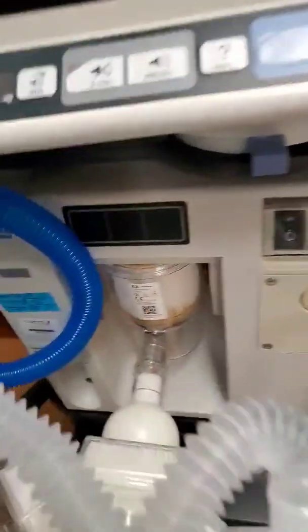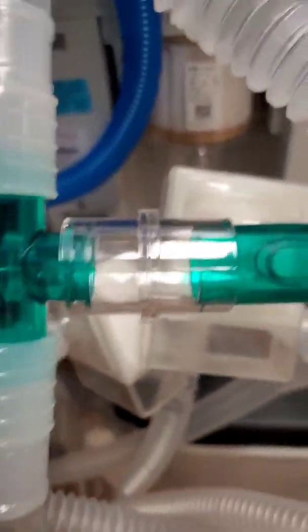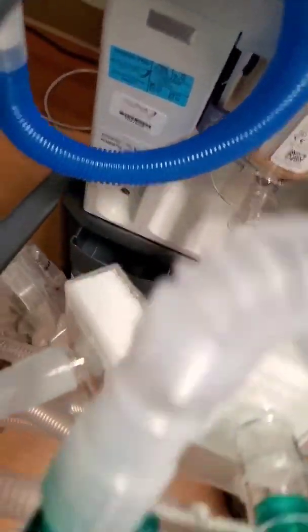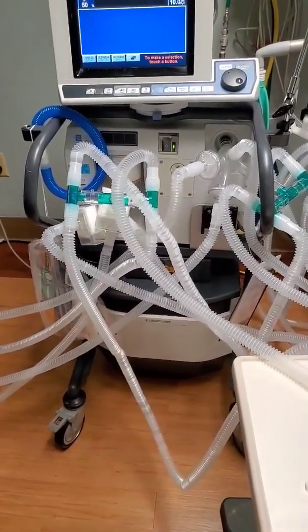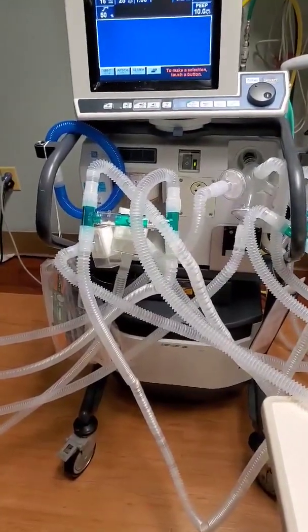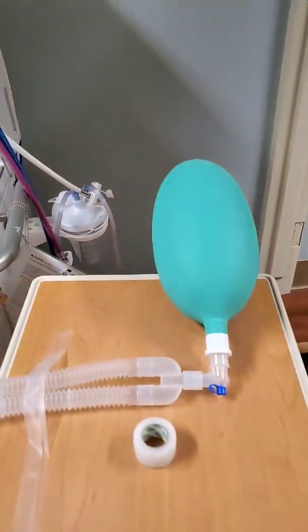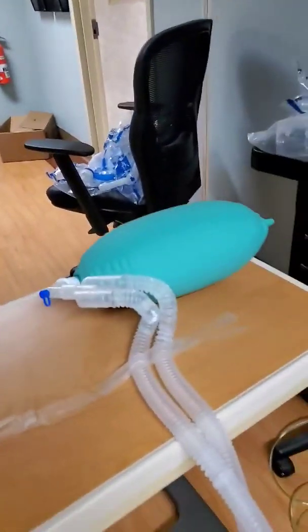And then on the exhalation part, again the similar thing — we have a different color for this so we can separate them out. These are again the filters we have placed in, and you're seeing the T-pieces connected with two extra ones on each side. There are three others connected to this as well. So when you step back, you see all of these different tubes, which are truly confusing, but there's a method to this madness. That method is allowing us to currently ventilate one, two, three, four, five, six, and seven patients.